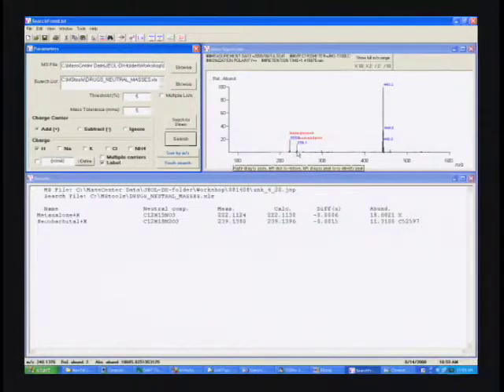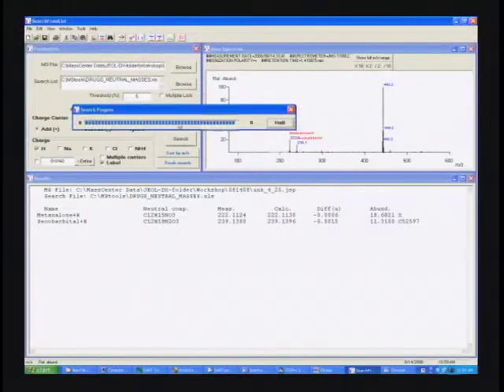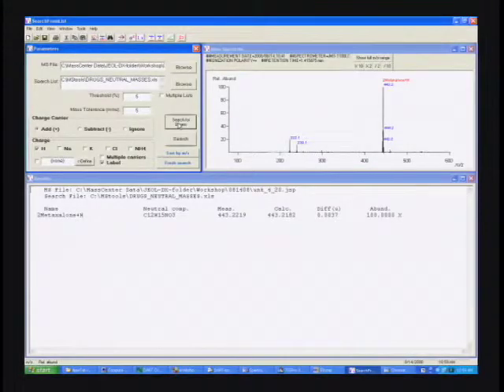Now the secobarbital may or may not be present, metaxalone may or may not be present, but we'll have to confirm from there what it possibly could be. But that would give us an idea on our screening that we have one or both of those particular drugs present. Now we can search for dimers, and we'll find that that 443 peak is in fact the metaxalone dimer, which helps us to determine that that's probably what we have in this particular sample. Certainly it could be a mixture.